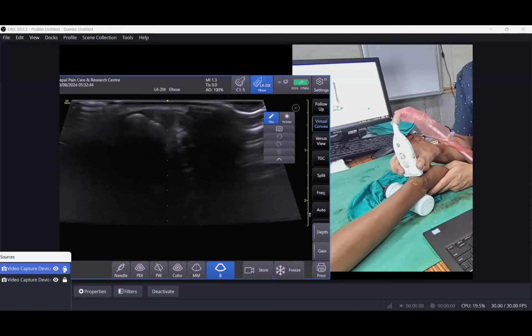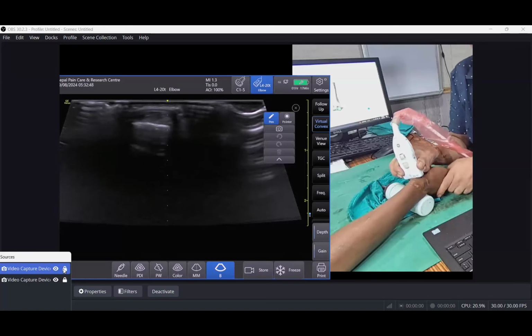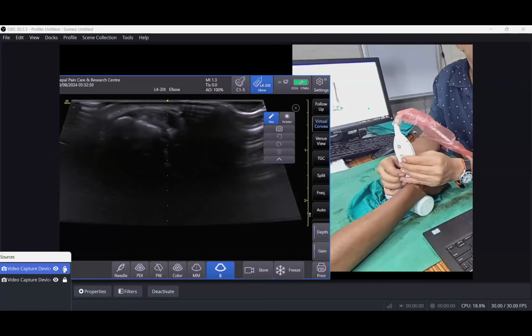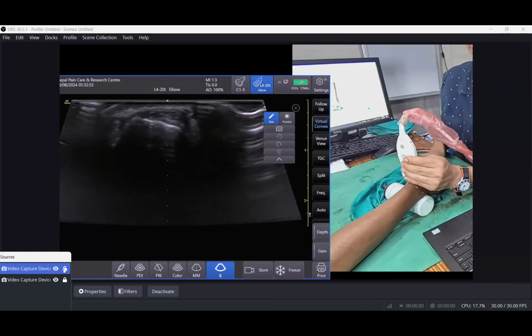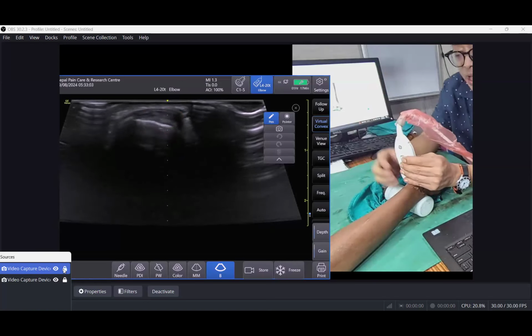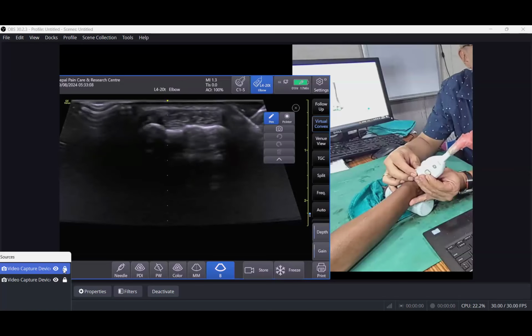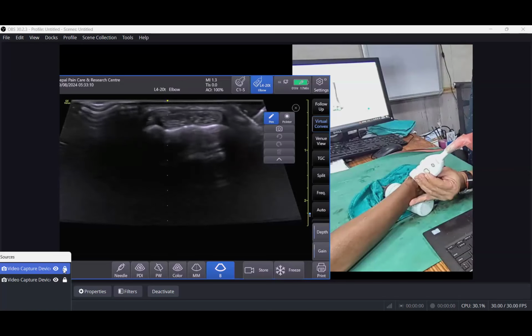Here you can see De Quervain's tenosynovitis. Many patients will complain of pain in the lateral aspect of the wrist. So this one is compartment number 1. Here you can nicely see abductor pollicis longus and extensor pollicis brevis. Okay, this is compartment number 1. So if I go to the radial side, now you will see two different tendons. So this is compartment number 2, that is extensor carpi radialis longus and extensor carpi radialis brevis.